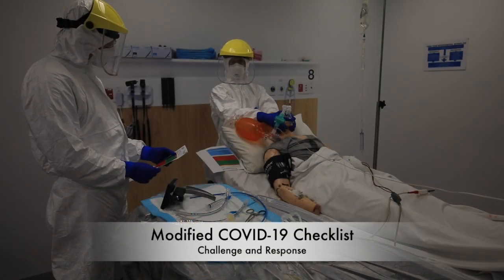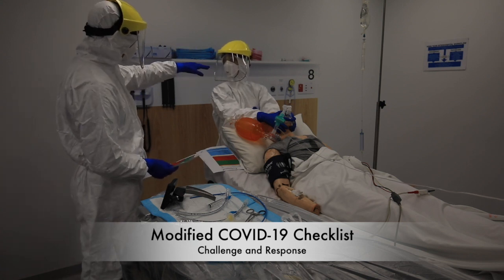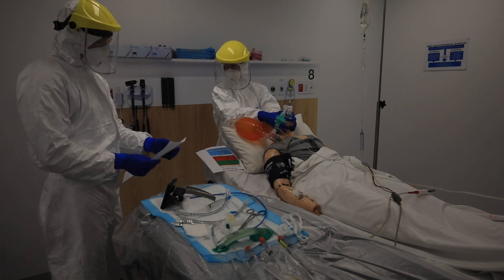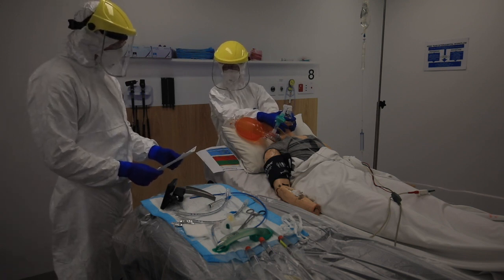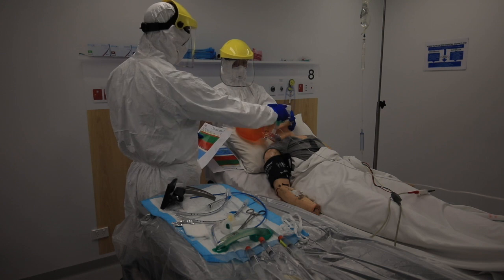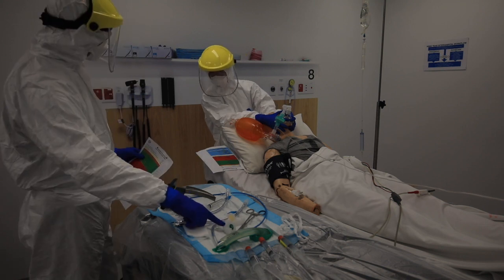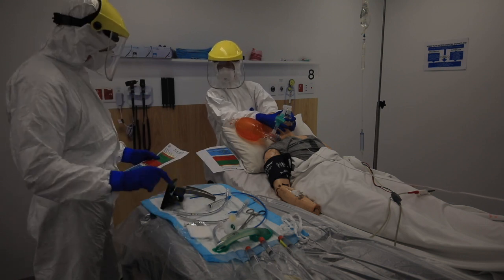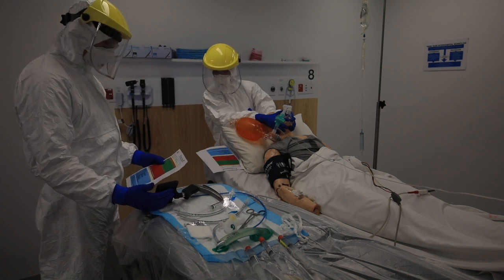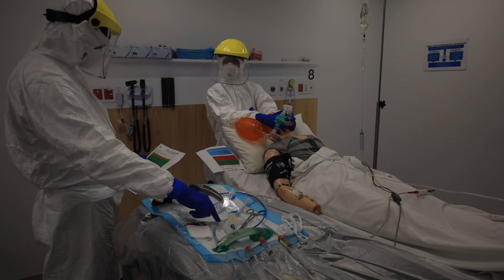Red check: Roles allocated — check. Drugs and doses — check. PPE body check — visor down, PPE mask on, other eye wear on — check for both operators. Orange role emergency group complete — check. Retrieval ventilator set up and checked. Circuit — gooseneck, HME and end-tidal, push and twist all connections — check. OPAs — check. NPA — check. Laryngoscope — bright, screen towards you — check. Tube checked and lubed, size 8 here — check. Backup size 7 — check. Tube tie — check.